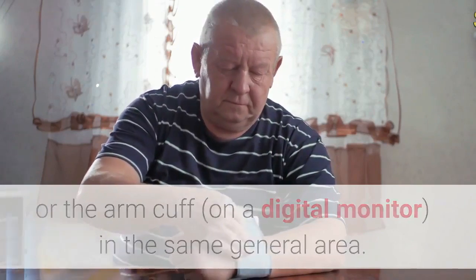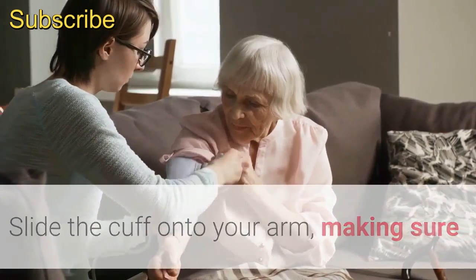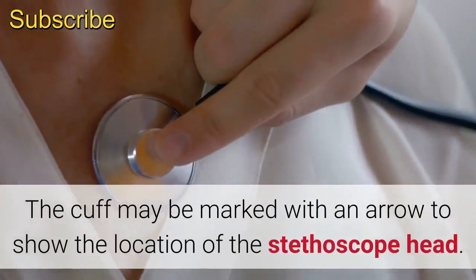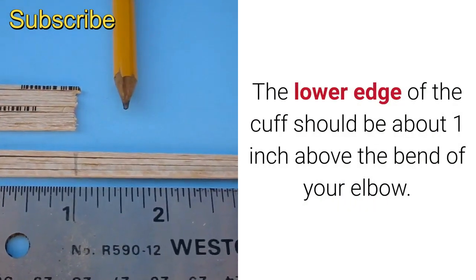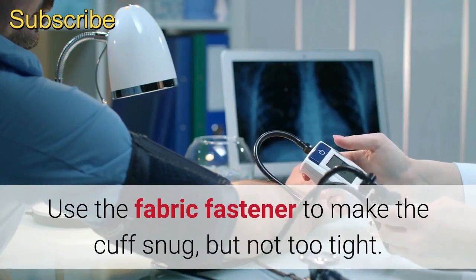Step two: secure the cuff. Slide the cuff onto your arm, making sure that the stethoscope head is over the artery. When using a manual monitor, the cuff may be marked with an arrow to show the location of the stethoscope head. The lower edge of the cuff should be about one inch above the bend of your elbow. Use the fabric fastener to make the cuff snug but not too tight.